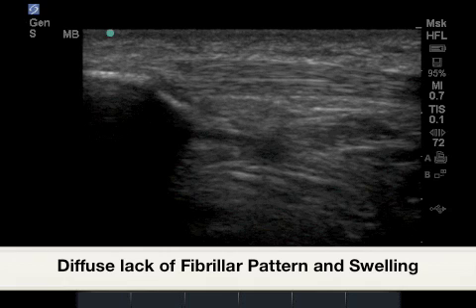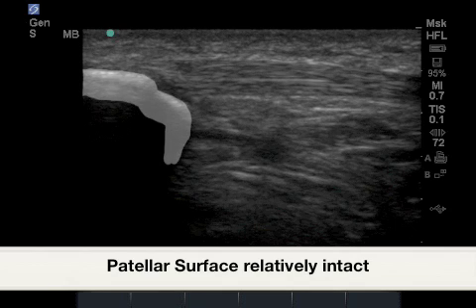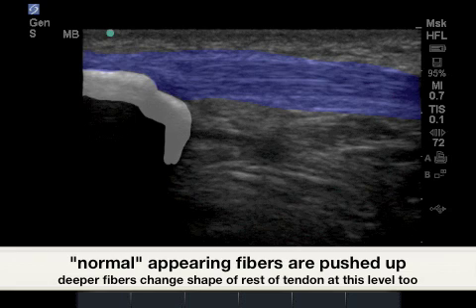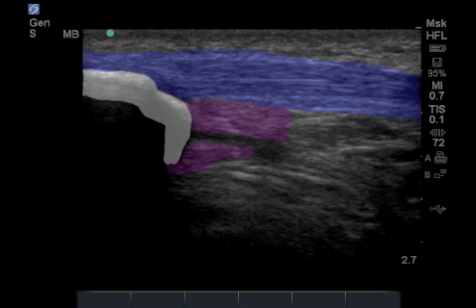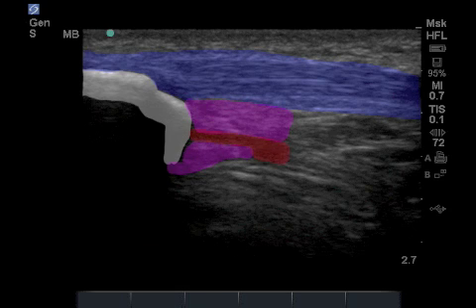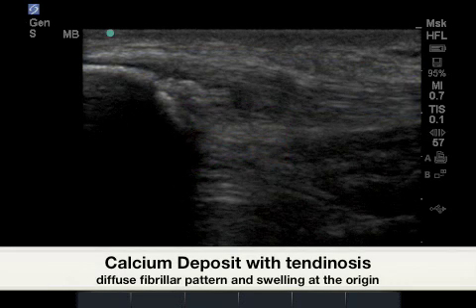In our next image, we see diffuse thickening of the inferior segment of the proximal infrapatellar tendon. Highlighted in white is the apex of the patella, which appears relatively unchanged. The more normal fibrillar pattern of the infrapatellar tendon is shown, with the purple indicating the diffuse thickened portion, followed by a hyperechoic single vessel likely caused by prior needle therapies to this site.